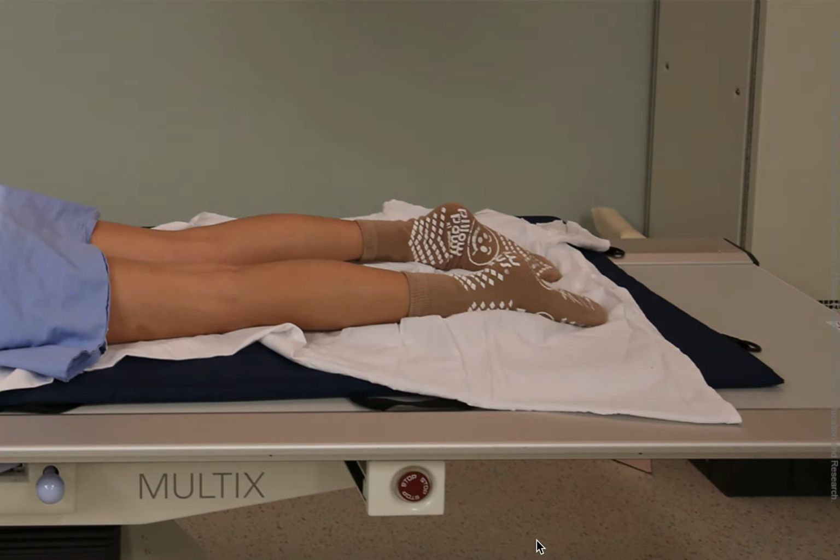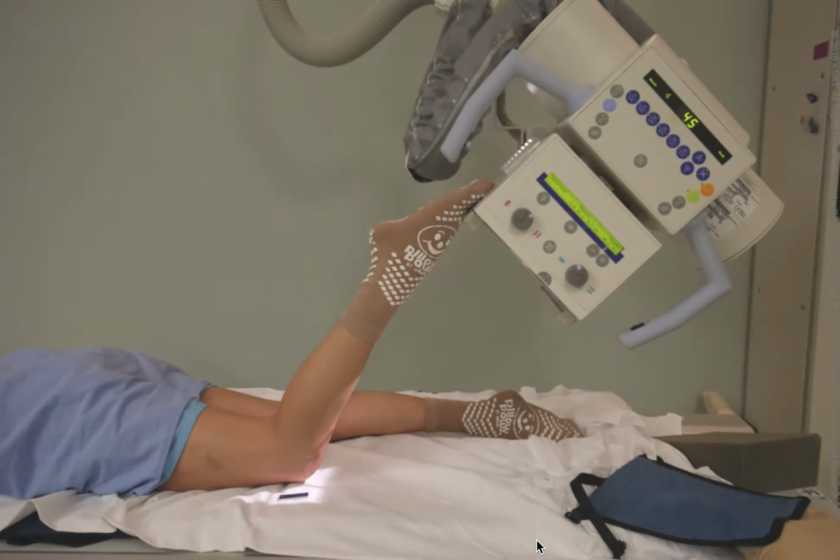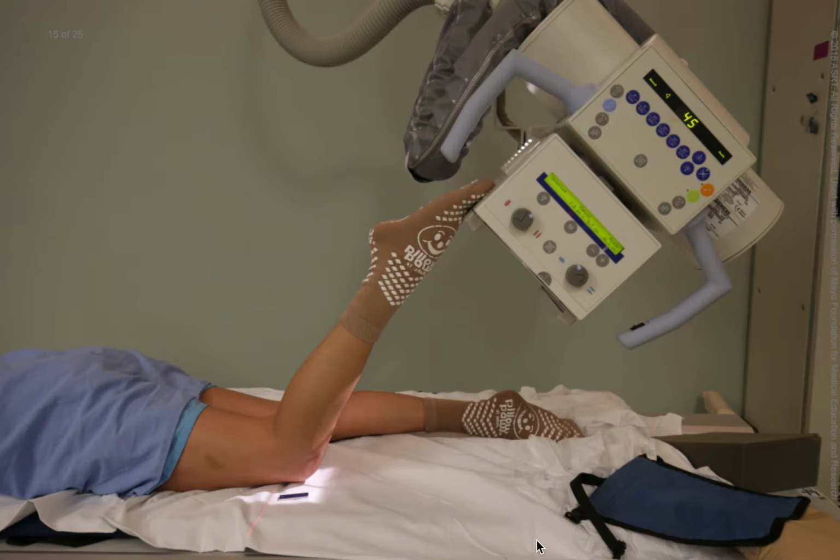Positioning for a tangential projection using the Houston method begins with the patient in the prone position with the affected leg extended. Make sure the patient's body is not rotated. The image receptor is positioned under the femoral part of the affected knee. Have the patient flex the knee until the tibia and fibula form an angle of 50 to 60 degrees with the plane of the table, and use a support device to help the patient maintain this position.